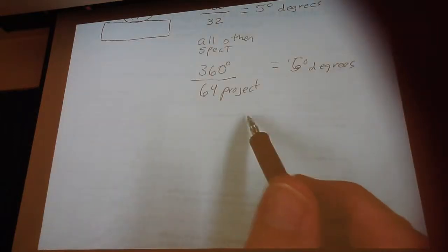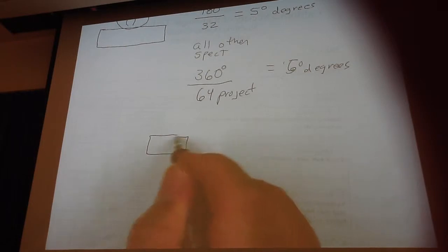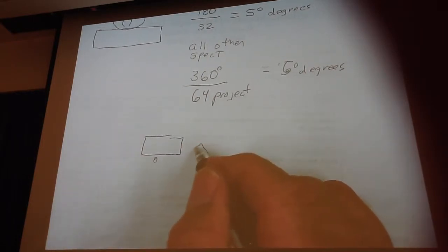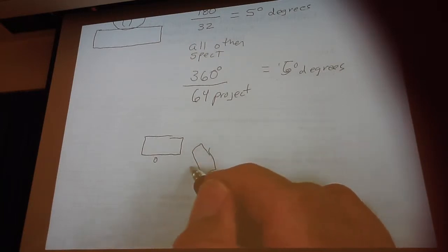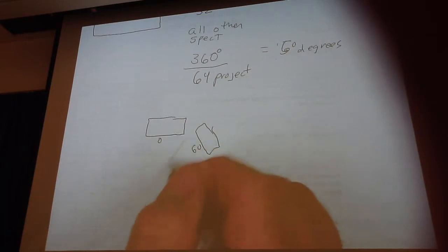And you're absolutely right. Let's just say that you go 6 degrees. So that means here's 0, and we do our next one at 6 degrees. What you wind up getting is what they call a spoke artifact.